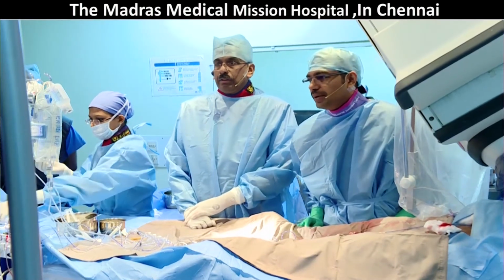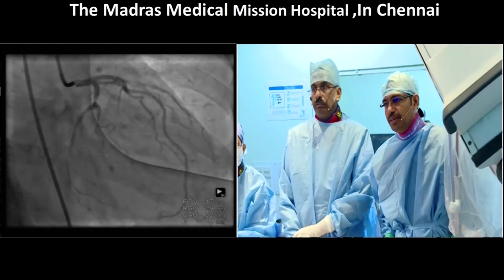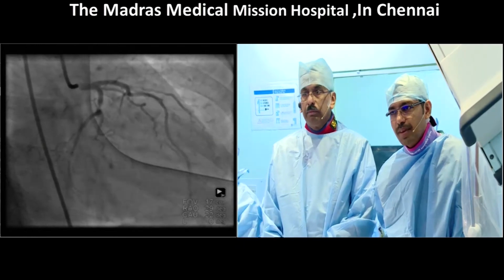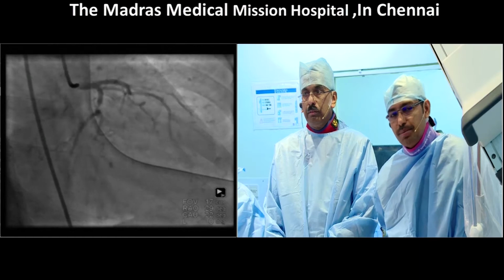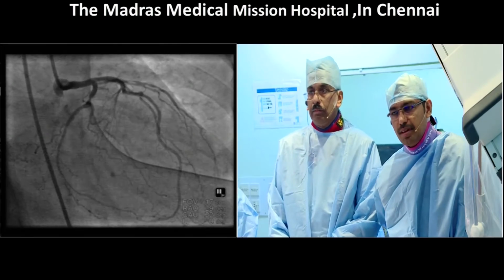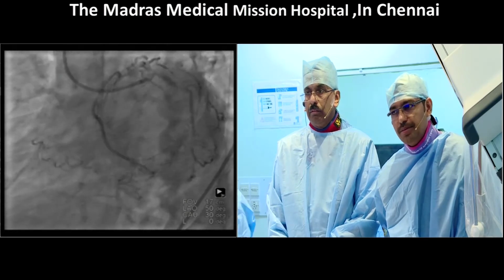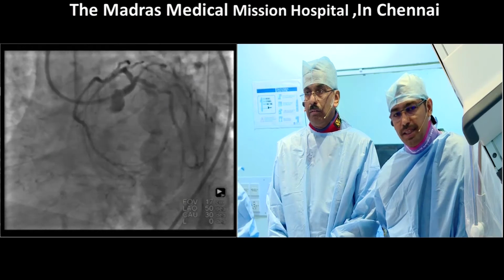Just start today's images, please. Can you see today's live images? Yeah, we can see that. There are two lesions. They are not actually tandem lesions, two separate ones. And angiographically appear to be good landing zones for both the stents. And the lady had inferior wall changes, so we did not do an FFR for this and directly went ahead with PCI.